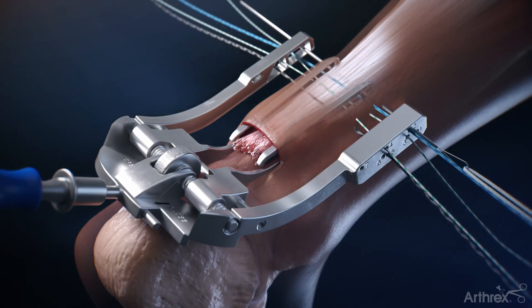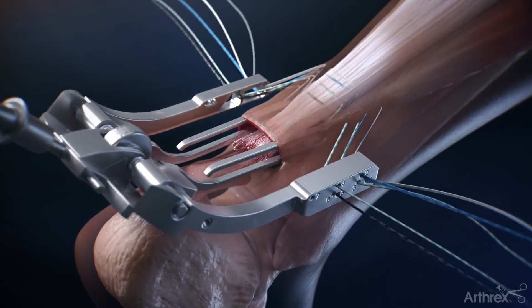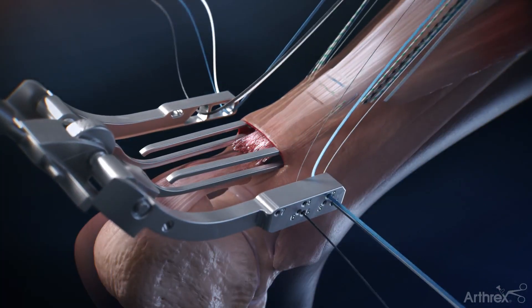Lastly, the white suture tape is then passed through hole number one. The jig can then be removed, which pulls the sutures out of the incision.